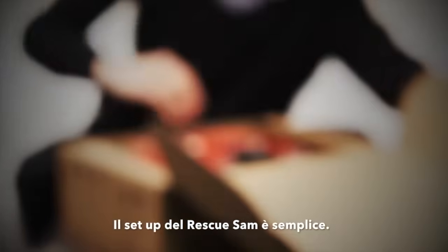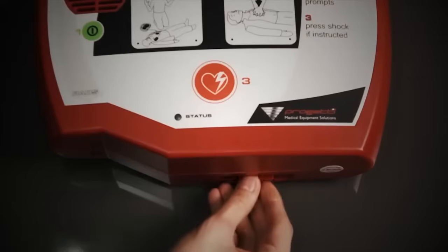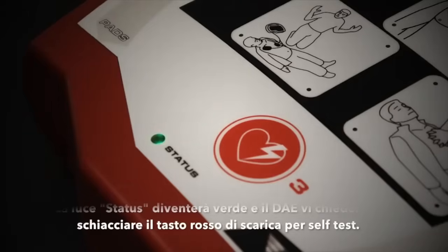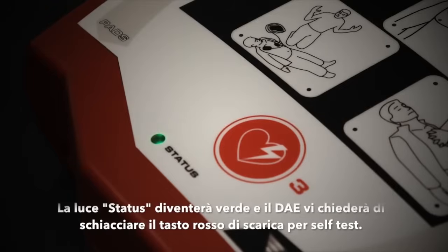When the Rescue Sam arrives, setting up the machine is easy. Simply insert the battery into the base of the defibrillator. The status indicator will light up green and a voice prompt will ask you to press the red shock button to complete a self test.